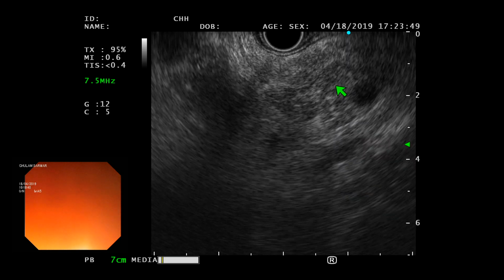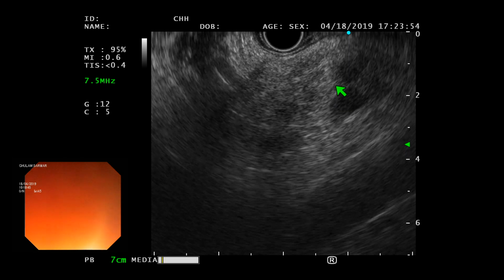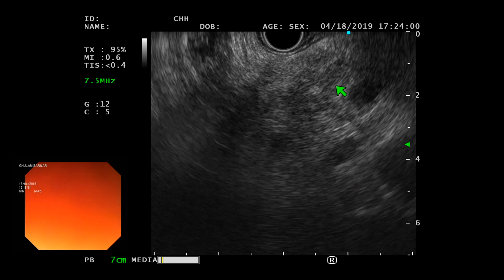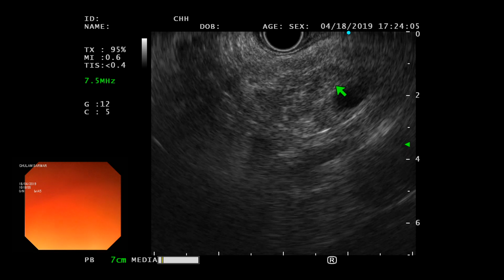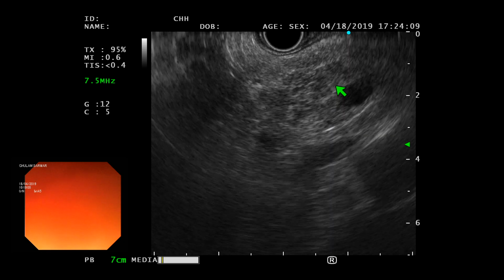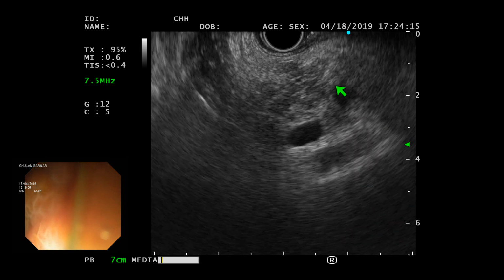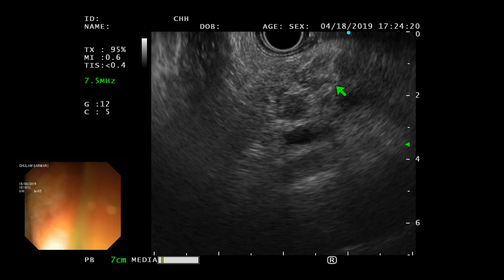No, the objective was scope handling and finding the aorta from right below the GE junction, finding the celiac artery, finding the 3 branches of that, tracing that towards the pancreatic body, and then looking at the body and tail of the pancreas, and to some extent the head. So mainly what we do for the pancreas in the stomach. So that was our objective. We have achieved that, we have done that 3 times. Well done. Yeah, so I think scope handling is pretty good.